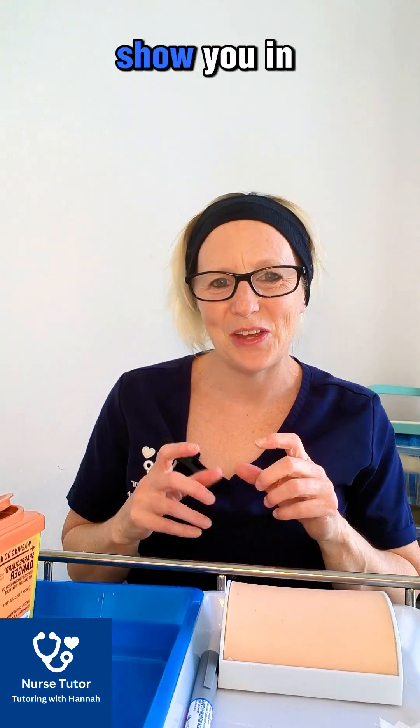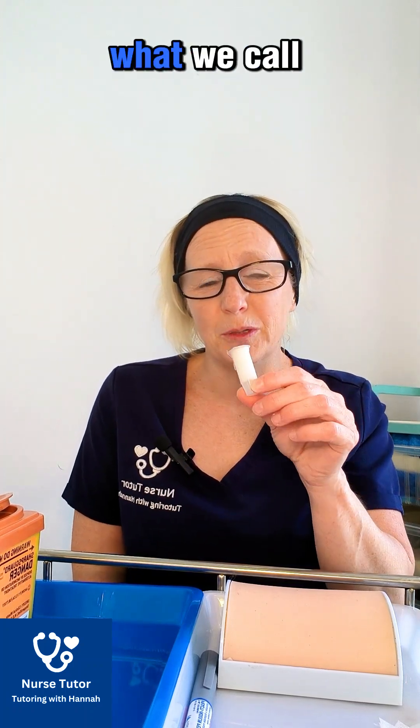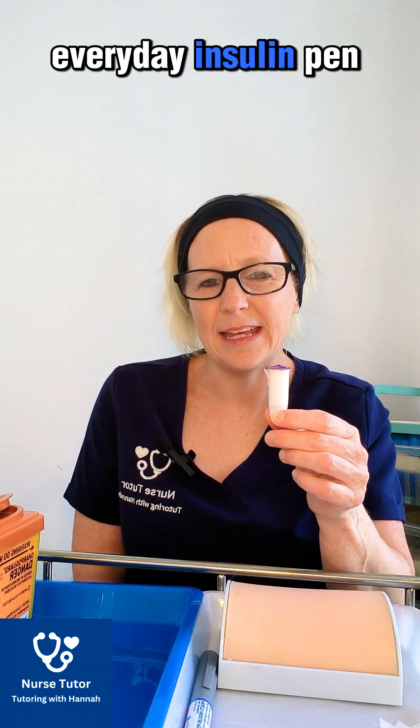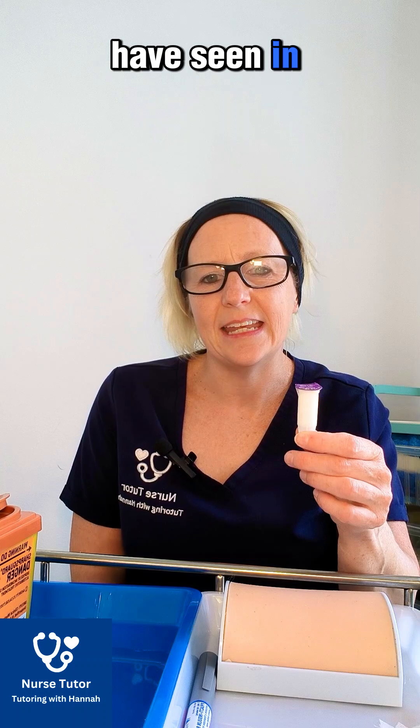Welcome to this video. I'm going to show you the insulin pen needles, because the ones they use at the test centre are what we call dual safe needles, and they're slightly different to the standard everyday insulin pen needles that you might be using in training or might have seen in videos.